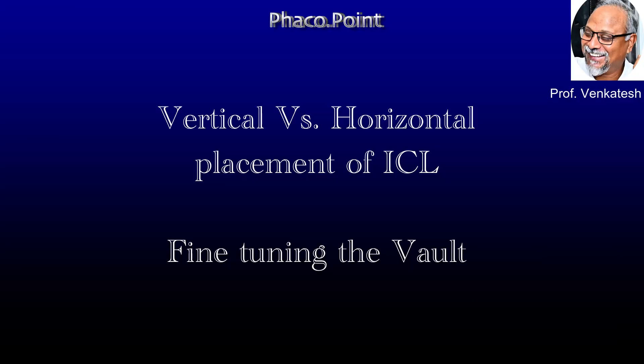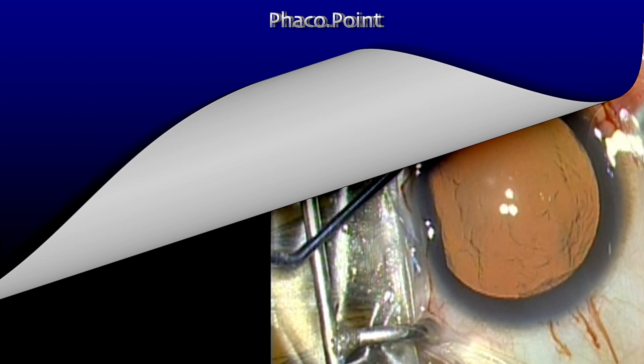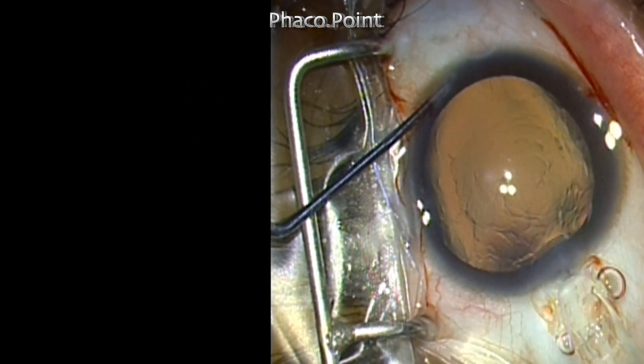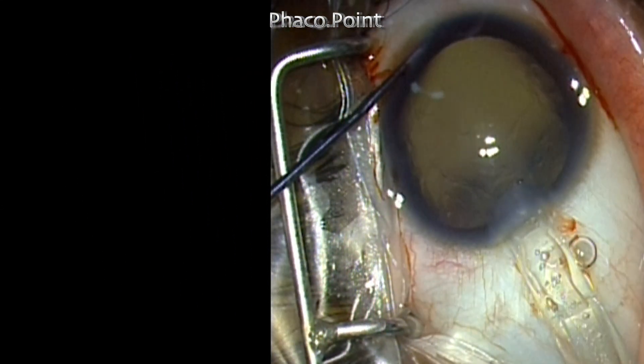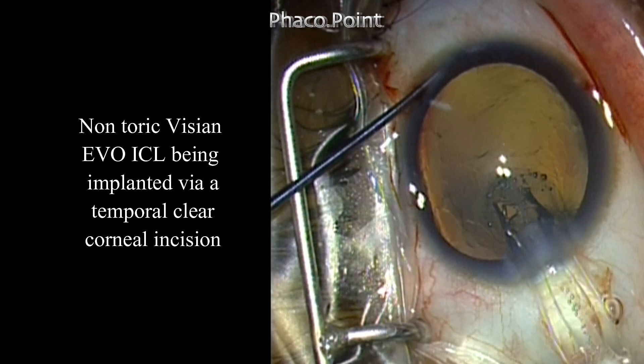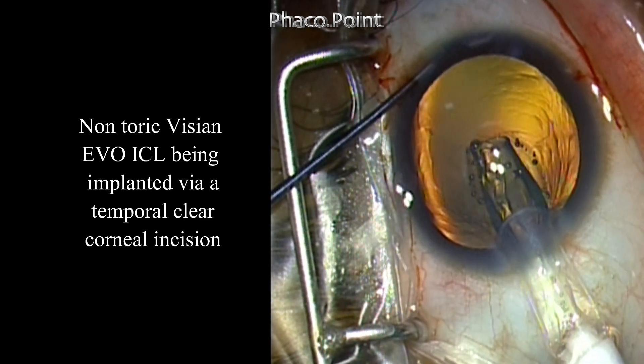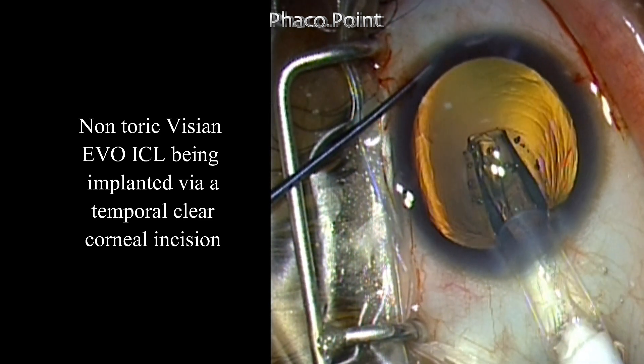Hello dear friends. I wonder how many of you are actually aware that by changing the placement of the ICL from horizontal to a vertical position, you can actually change the amount of vault that you get after implanting the ICL. What you see here is a non-toric Visian EVO ICL being implanted.